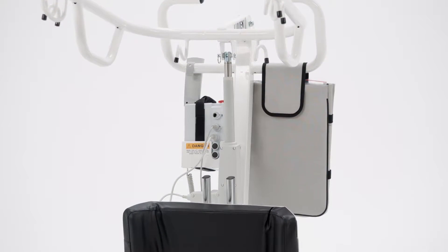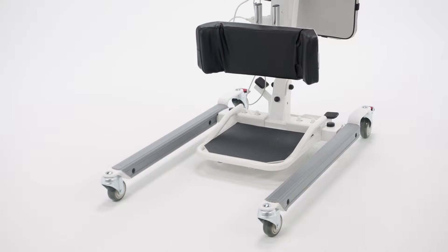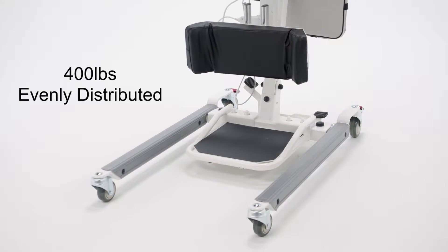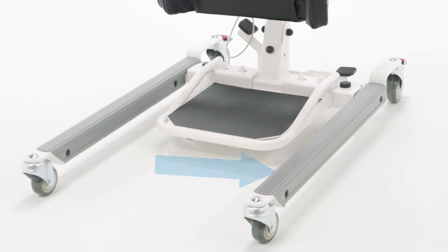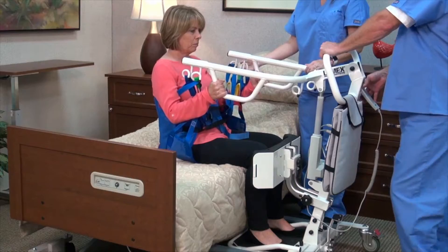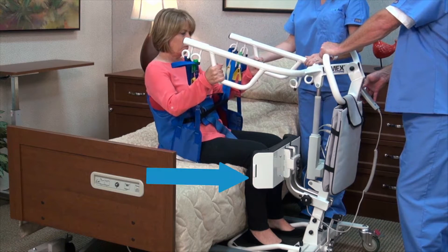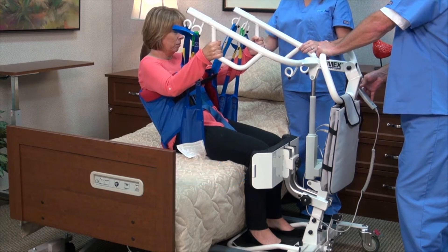The LF-2020 utilizes heavy-duty steel construction to support patients weighing up to 400 pounds evenly distributed. A white powder coat finish and rubber-coated legs protect the lift as well as walls and furniture. The adjustable padded knee pad both supports and protects the patient's legs during the lifting process.